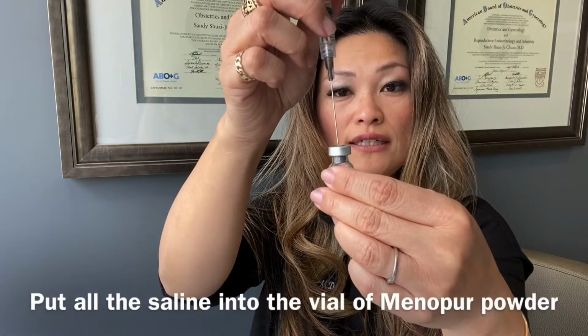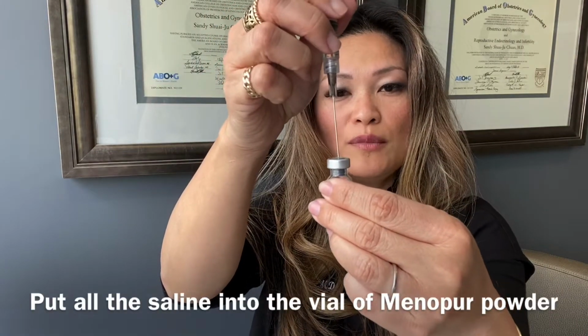Just know if you're off by a teeny bit on the volume, that's okay. It doesn't have to be that precise, but close to the 1 ml is good, because you're just interested in dissolving the powder, and that will be more than enough. Then you take your first vial of the powder, and you can see the white? That's the powder, okay? I've already cleaned it before, remember? If you can't remember, clean it again.